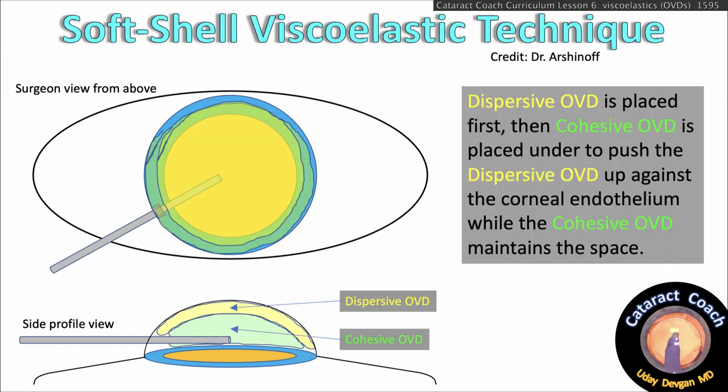There is a soft shell technique. We'll talk more about that. This is the surgeon view from above. You can see the soft shell technique described by Arshinoff is to have both a cohesive and a dispersive in the same eye.